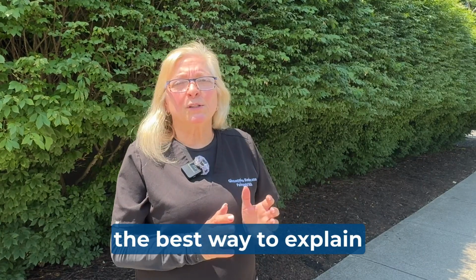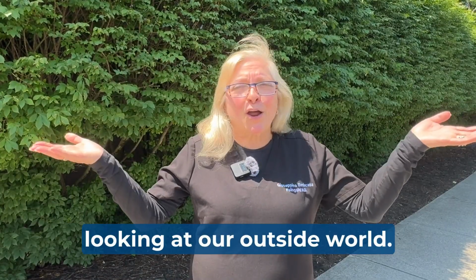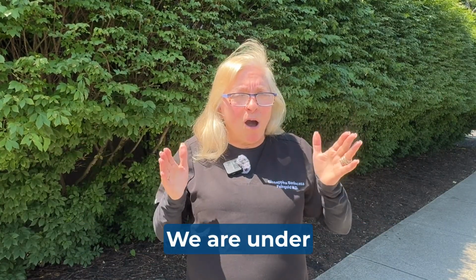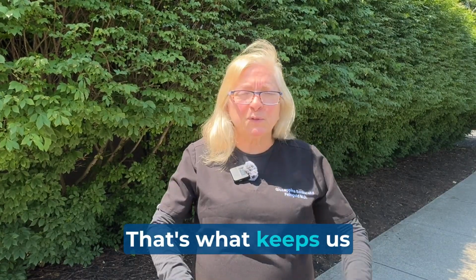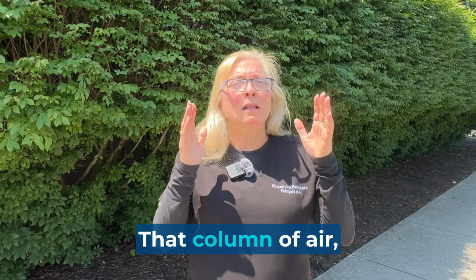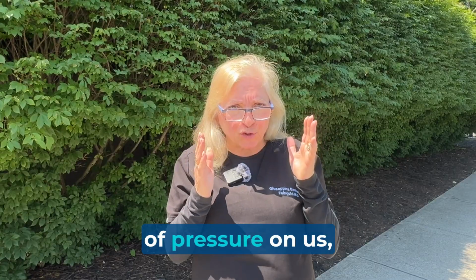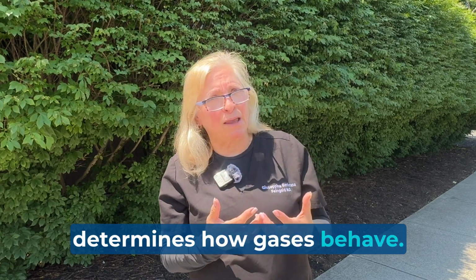The best way to explain hyperbaric oxygen therapy is by looking at our outside world. We are under a column of air. That's what keeps us on the planet. It keeps us on the ground. That column of air, of pressure on us, atmospheric pressure, determines how gases behave.